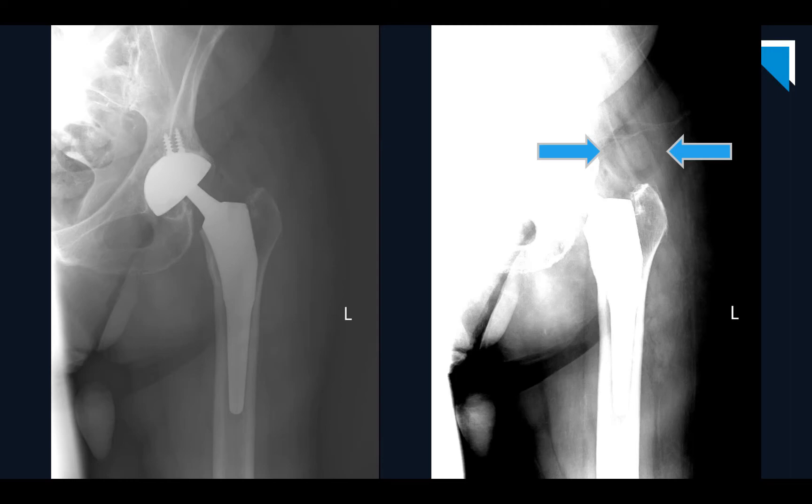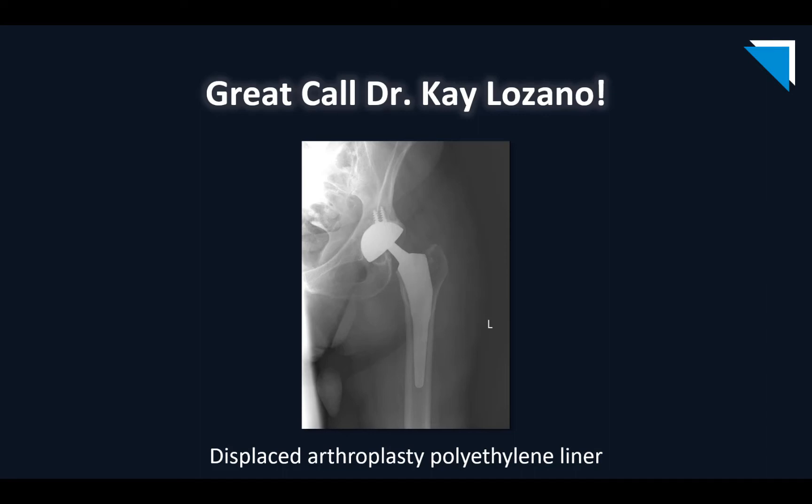Dr. Lozano noticed that, talked to the surgeon, and the surgeon took the patient to the OR and confirmed that's exactly what happened. Great call, Dr. Lozano, on recognizing this complication of total hip arthroplasty — a displaced arthroplasty liner — a pretty subtle finding on this hip x-ray. Good job, Katie.